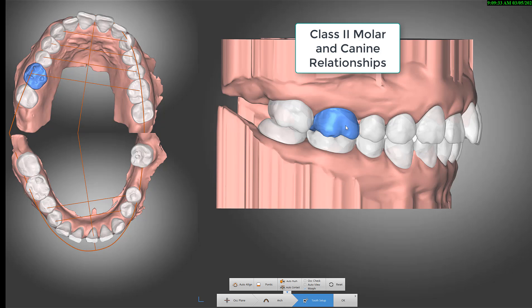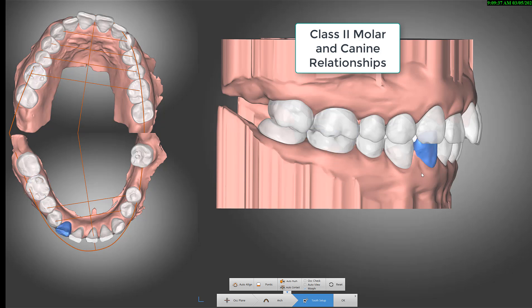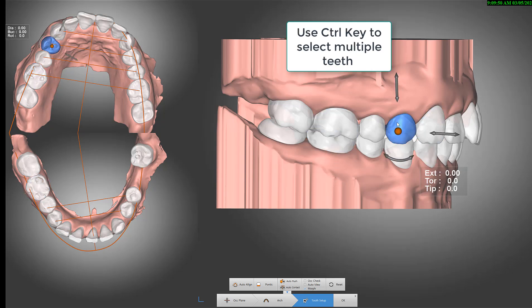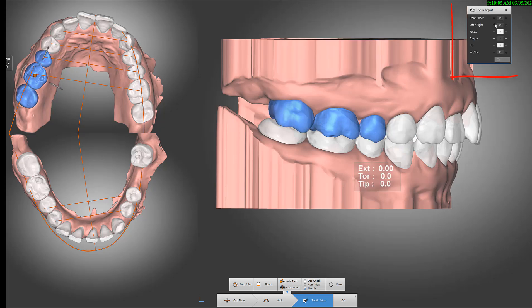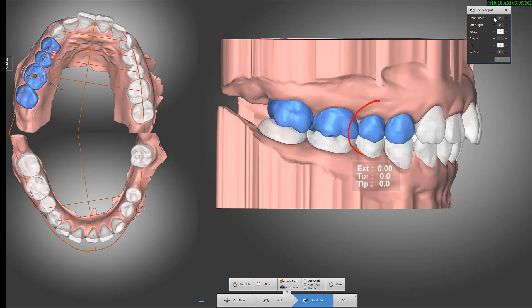Sometimes we can do class 2 distalization in cases of moderate class 2 relationships. You distalize the upper teeth, press Control to select them all, and use the table right here to distalize the teeth.